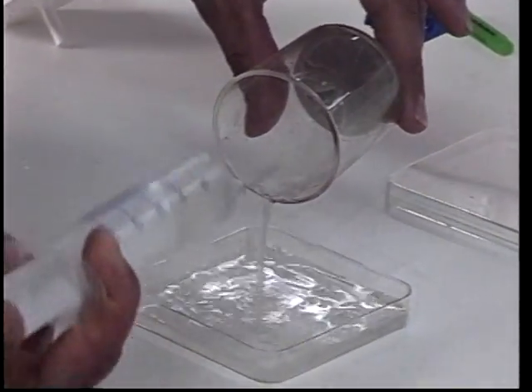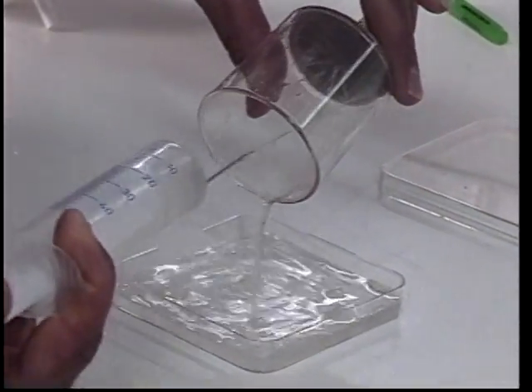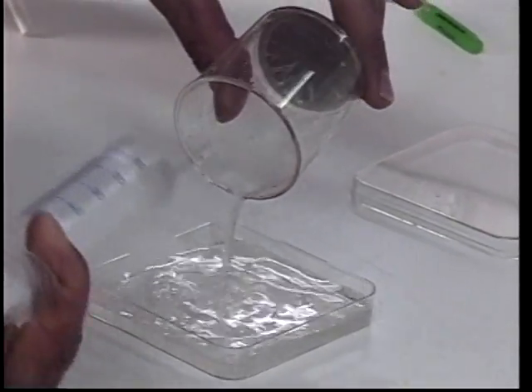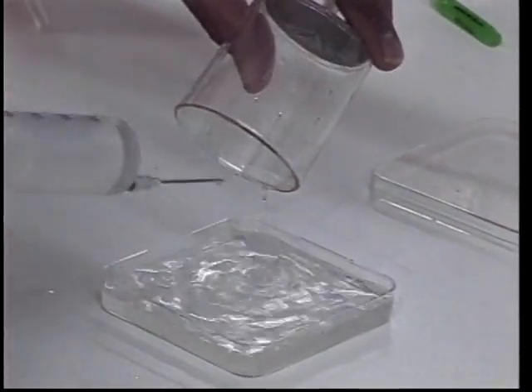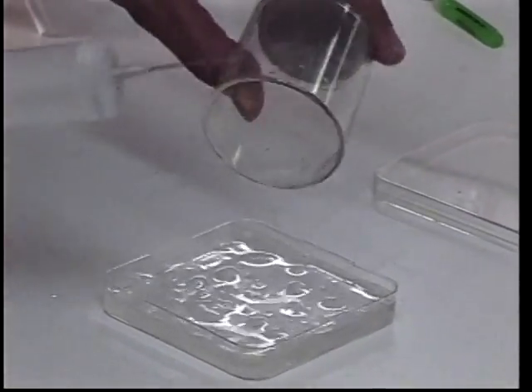We carefully rinse off the filter screen. It is very important that a firm stream of solution is used to rinse the filter, removing all of the debris and mucus which may be attached to the filter.